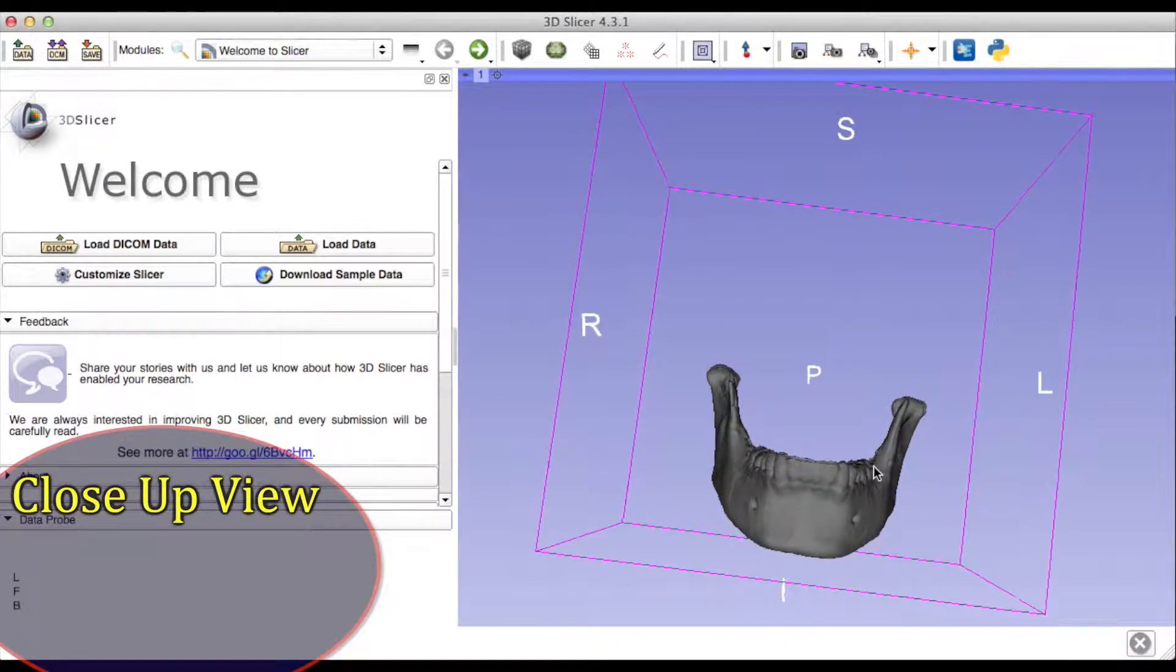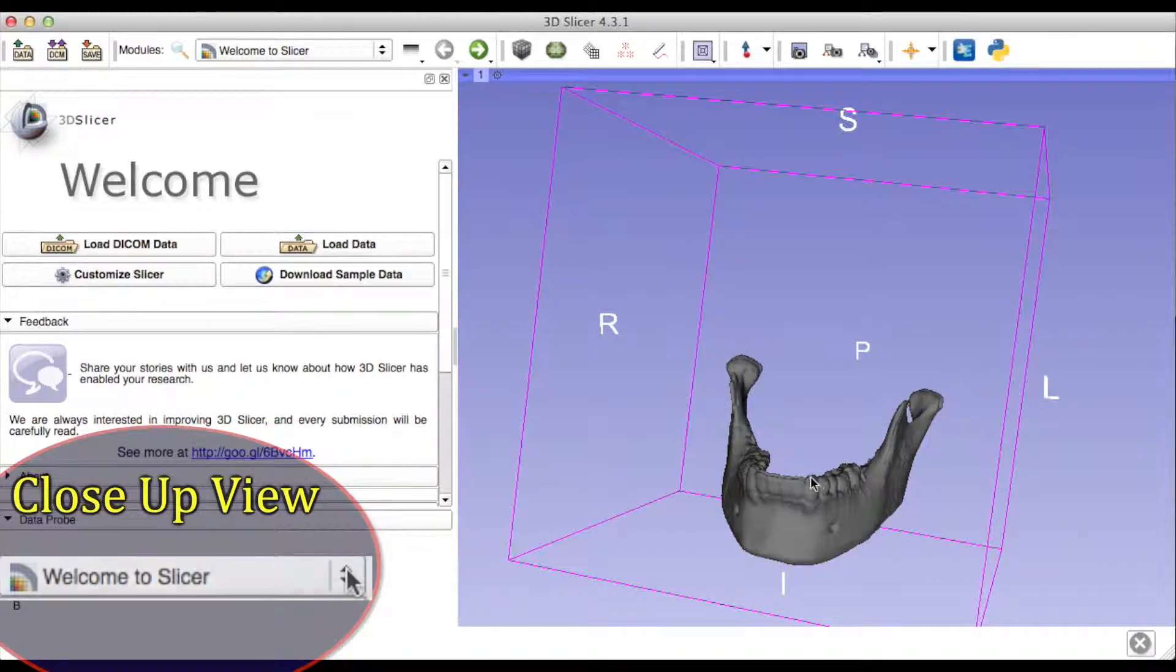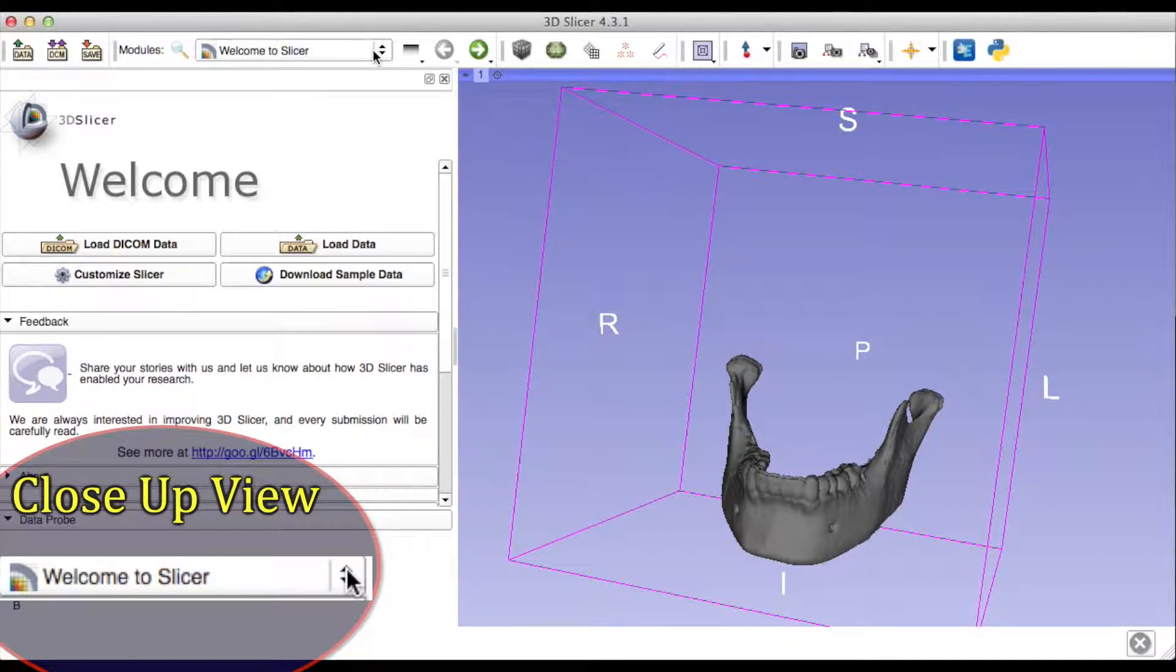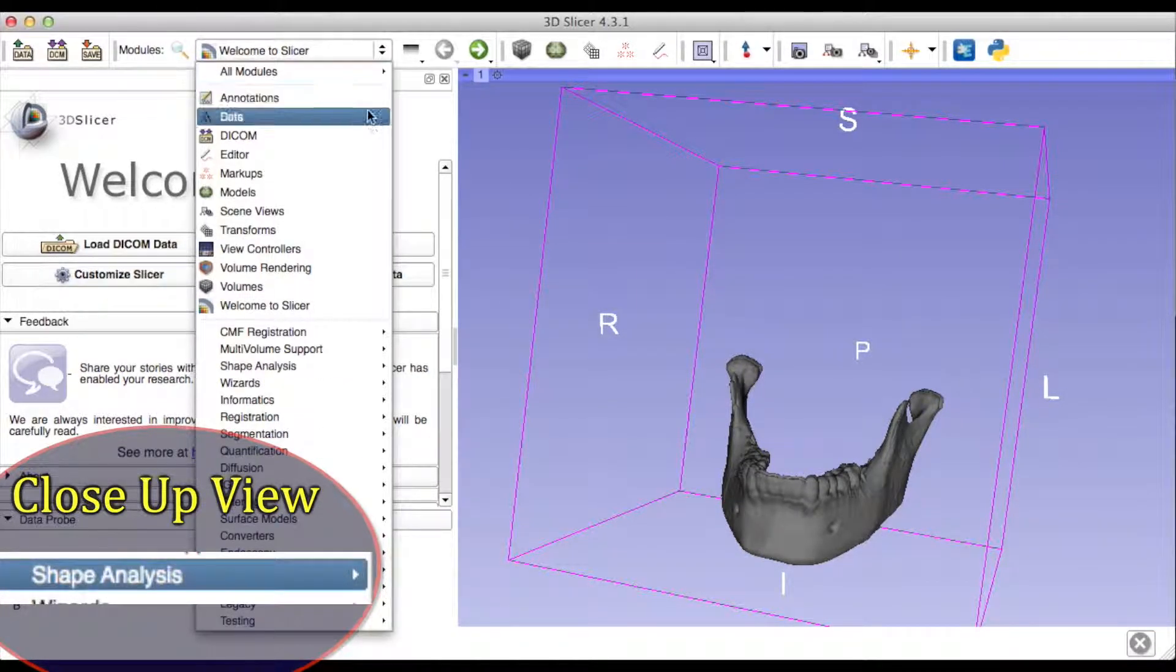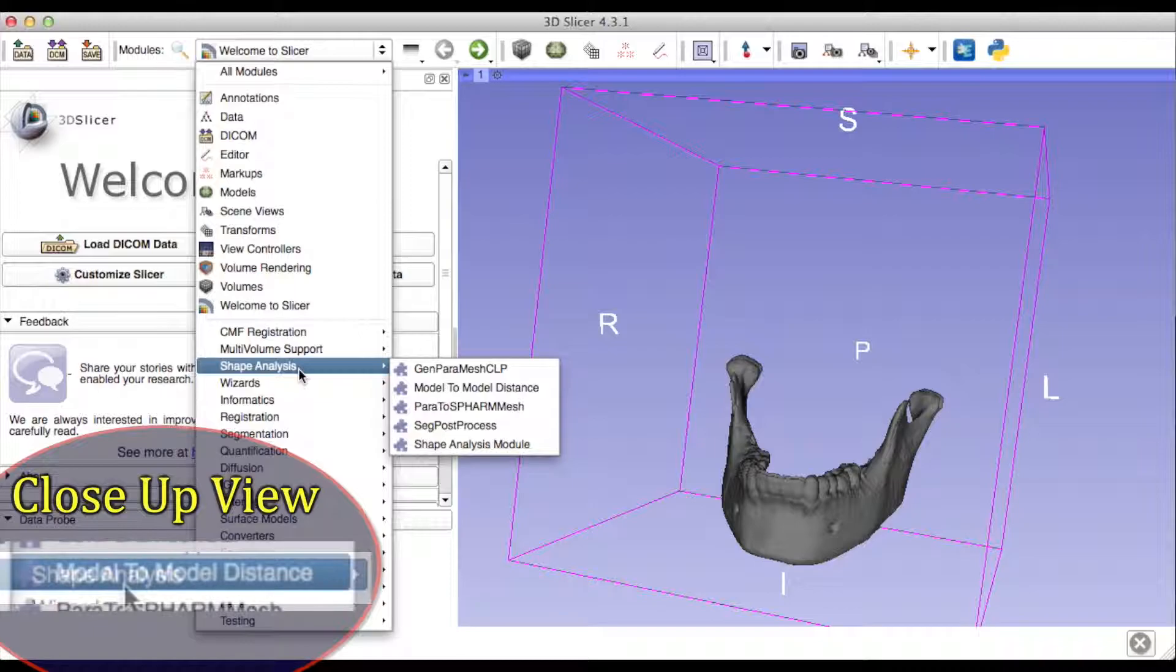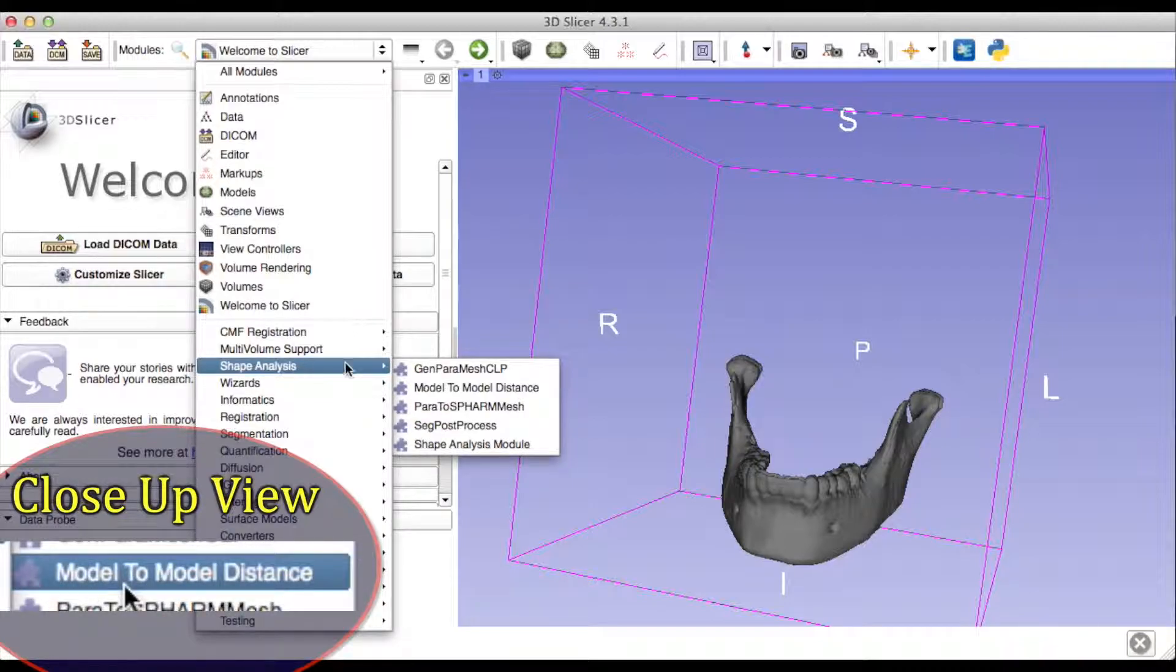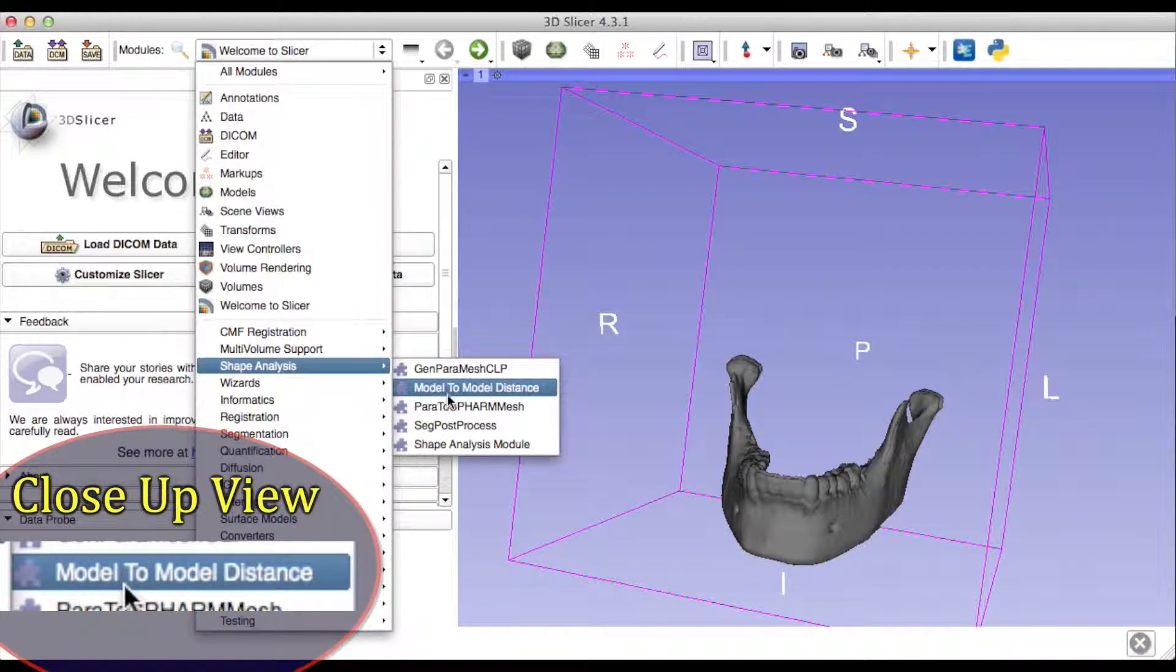Go to the Modules drop-down menu, select Shape Analysis, and then click on the Model-to-Model Distance module.